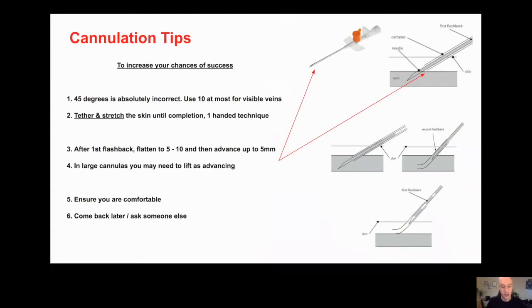If you can see a vein, it's very superficial, it's going to be flat. So you need a very shallow angle. So I'm saying 10 degrees at the very most.